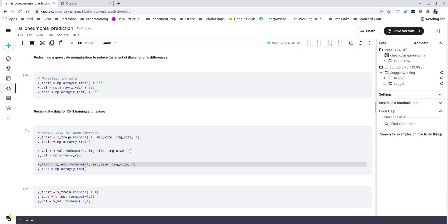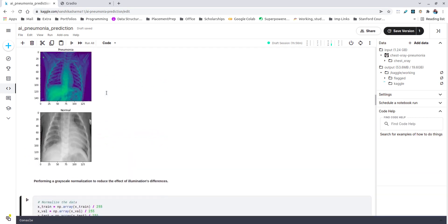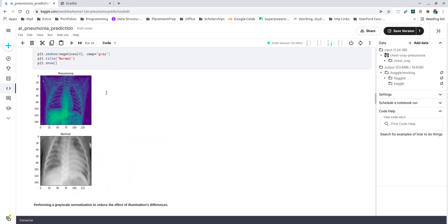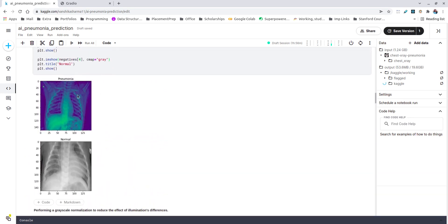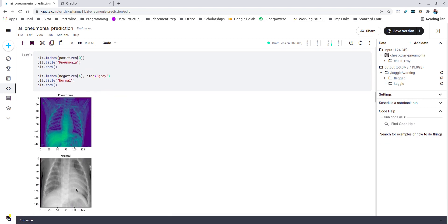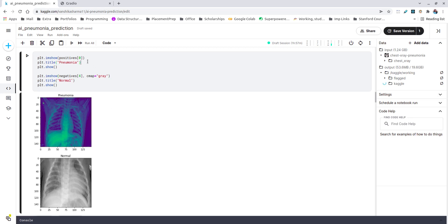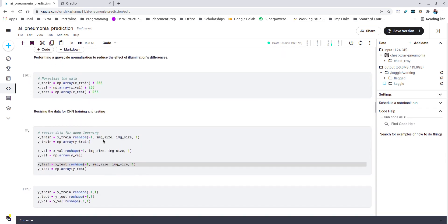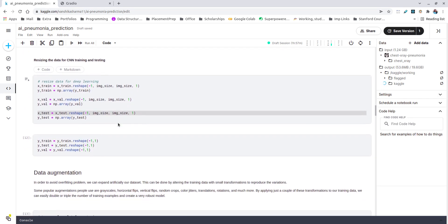I normalized the dataset and performed a simple grayscale normalization to reduce the effect of illumination. Illumination can be characterized as this colored image which I have displayed of pneumonia and this gray image of the normal chest X-ray. When we try to store a colored image, we basically make three matrices, each for every color RGB—red, green, and blue—which indirectly increases our size of the model as the size of the input features increases. We can see the difference between the two; we can see the fuzz clearly in the gray image, so that is why I went on with grayscale normalization.